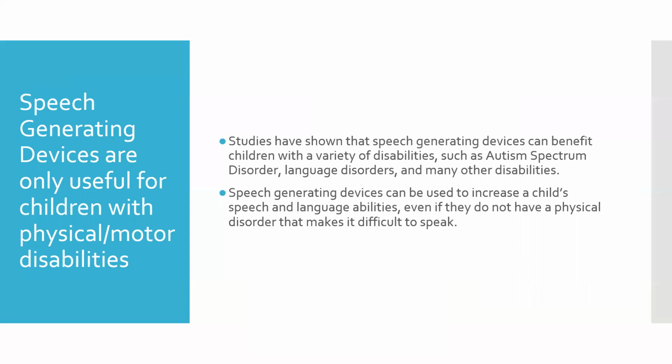The next myth is that speech-generating devices are only useful for children with physical or motor disabilities. As we talked about earlier, there are a number of studies showing that speech-generating devices can benefit children with a variety of disabilities, such as autism spectrum disorder, language disorders, and many other disabilities. Speech-generating devices can be used to increase a child's natural speech abilities, even if they do not have a physical disorder that makes it difficult to speak.